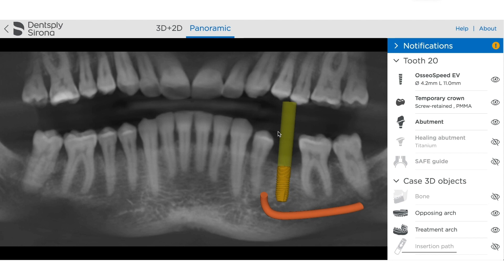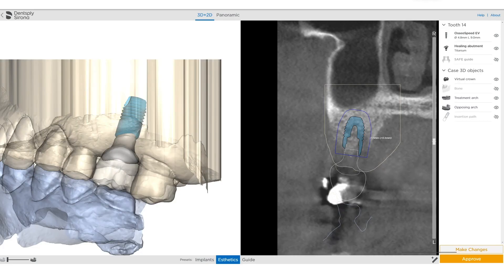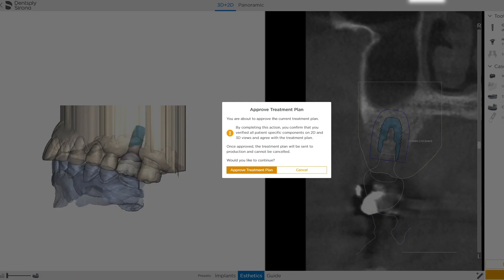Finally, we can take a look at a panoramic view as well, just to see everything in relation to the whole picture. Once you've evaluated your plan, you have a couple of choices: you can either approve your plan or make changes to it. If you decide you like everything about it, clicking Approve will prompt you to confirm approval of the treatment plan once again, and that will start the actual fabrication process — so keep in mind that once you click approval, manufacturing is going to start immediately.